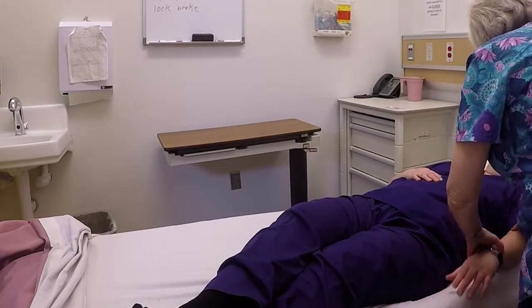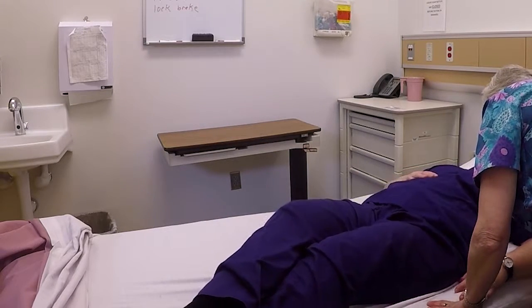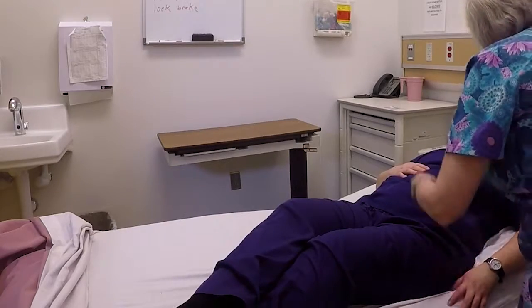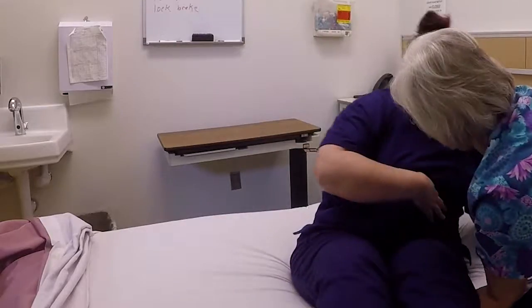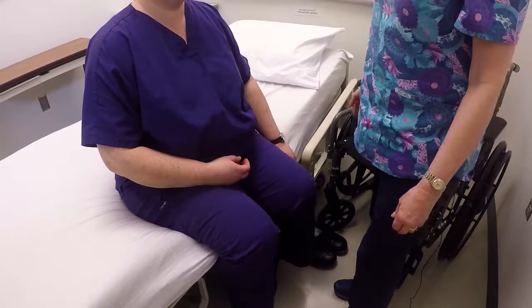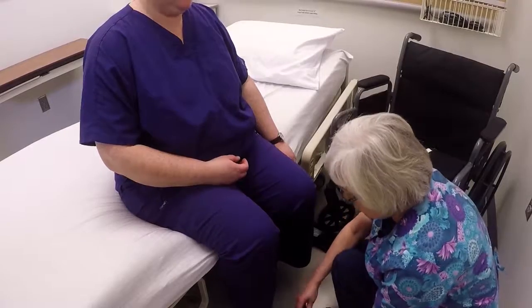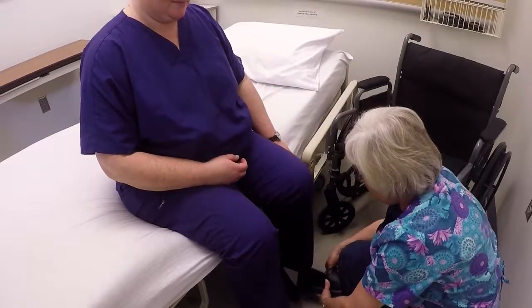I'm going to ask her with her elbow, kind of bring her upper body up just a little bit, and I'm going to raise the head of the bed slightly. And I'm going to assist her in getting in a seated position. Okay, Cindy is in a dangle position. I'm going to have her sit here for a couple minutes. In the process, I'm going to assist her with getting her non-skid footwear on.